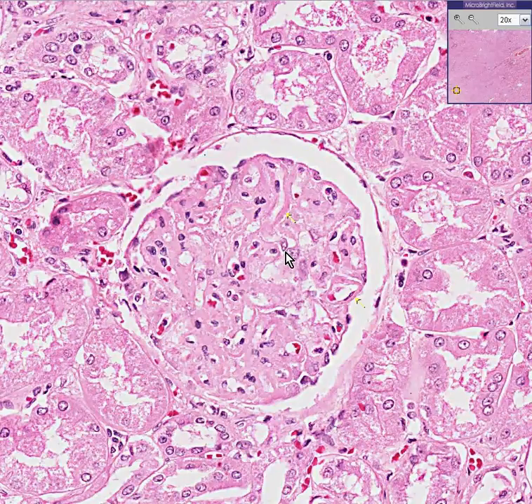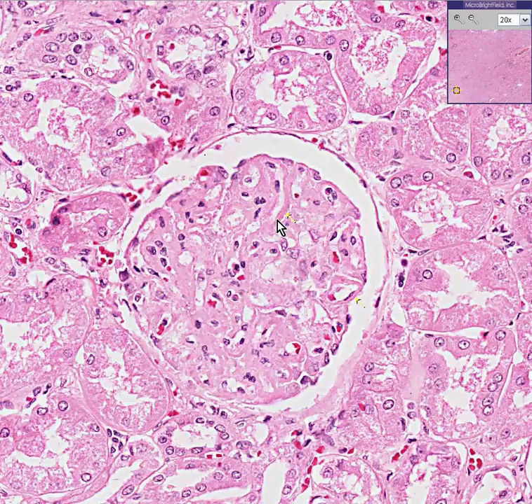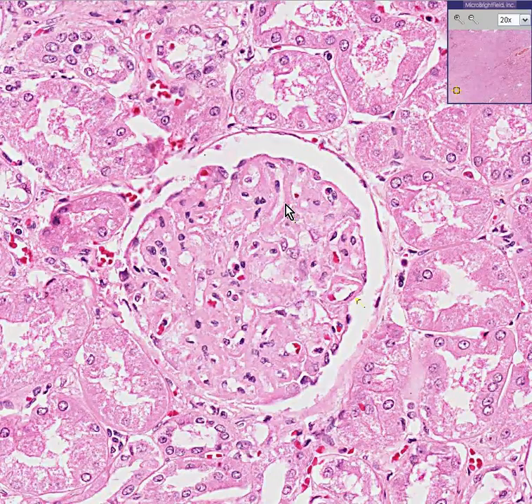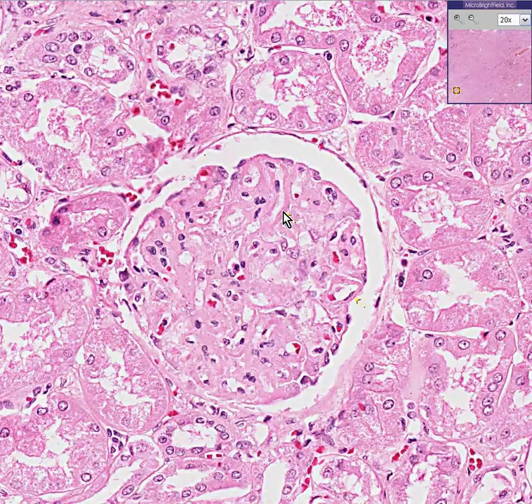There's a term called wire loops. Wire loops are nothing more than basement membranes which appear to be somewhat wiry, like a wire loop. That's what this yellow arrow would like to display as well. This is a very common finding in SLE, systemic lupus erythematosus, another autoimmune disease in which the body reacts to its own DNA.